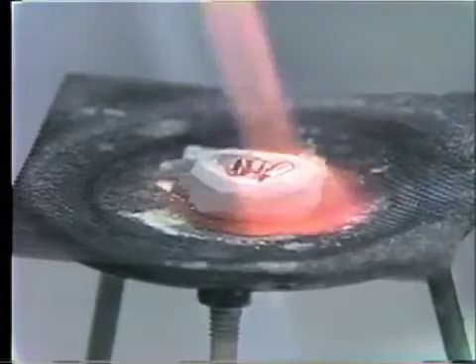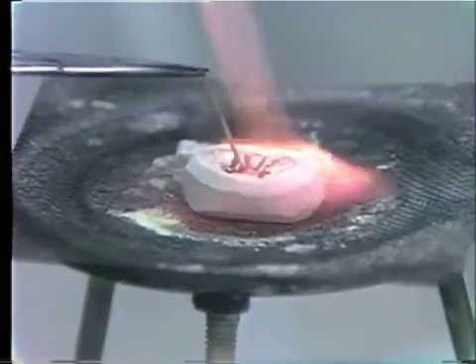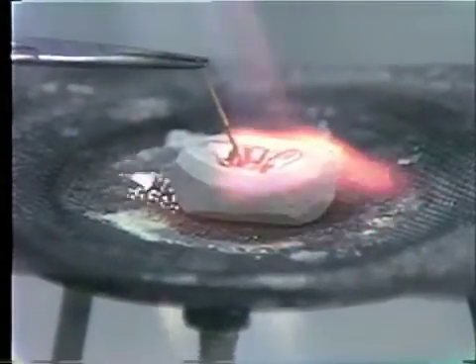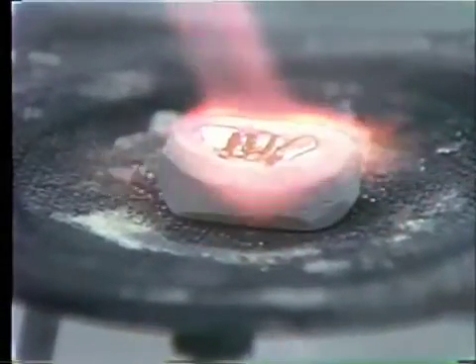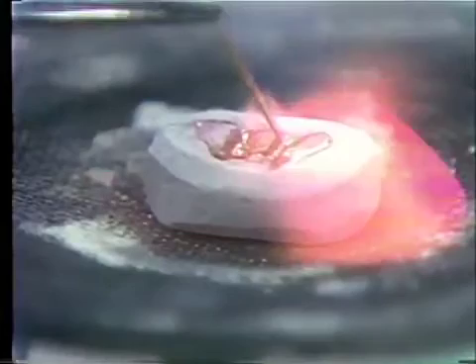You'll notice the access here will be directly on the linguals of these crowns. It's getting nice and hot, and we will flow the solder right in, in the proximal there. Reheat that a little bit to make sure it flows well around that, and also this distal area — you can see it flow. Add a little more here.